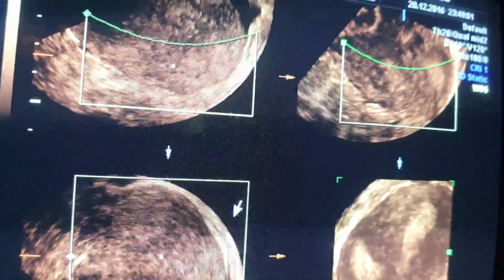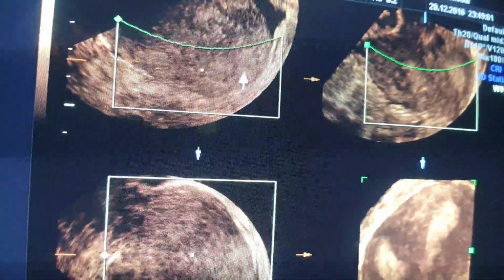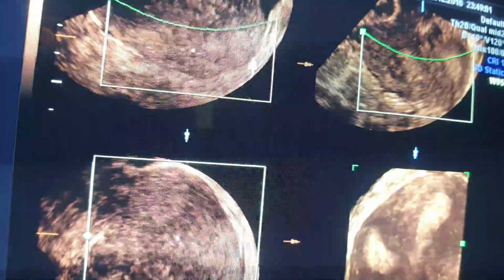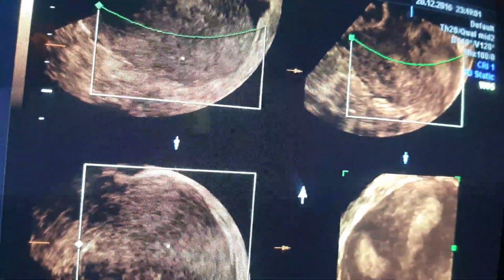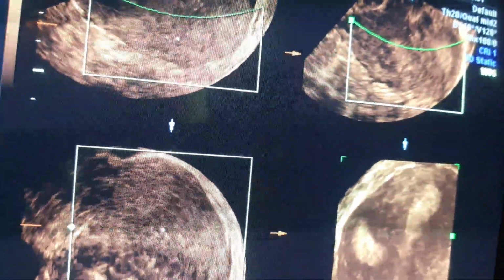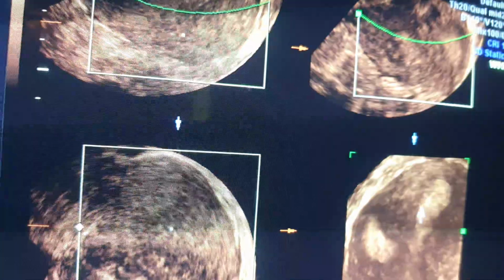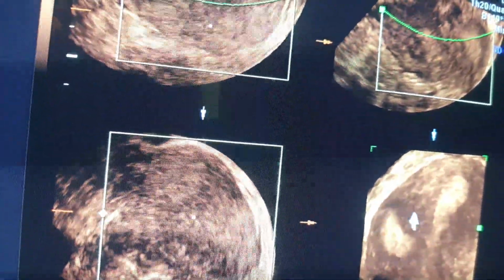I put an arrow to see with me here. As you can see here, I'm not focusing on the endometrium, if you notice. So if you look at this picture as just a 2D ultrasound picture, of course you will miss this diagnosis completely. And even if you use the 3D orthogonal planes and you have the first plane in which we started, you think that it's just a unicornuate uterus. But after having that analysis by 3D ultrasound and by using the 3D orthogonal planes, and properly understanding it, that was not just a unicornuate uterus, actually there is a horn. There is what's called a rudimentary horn.